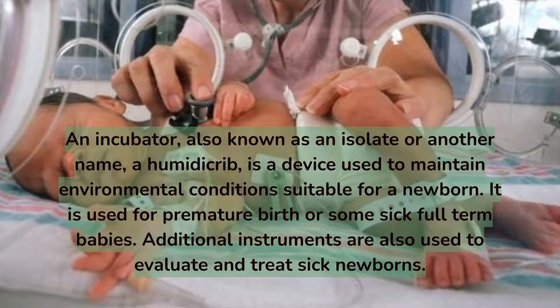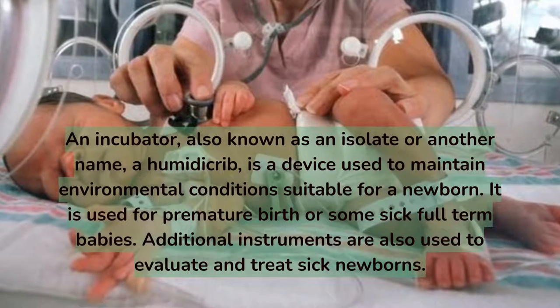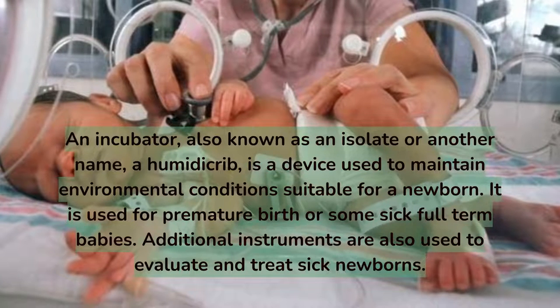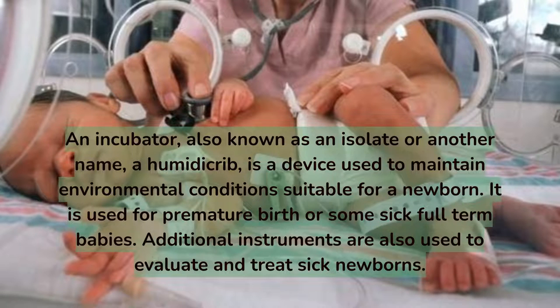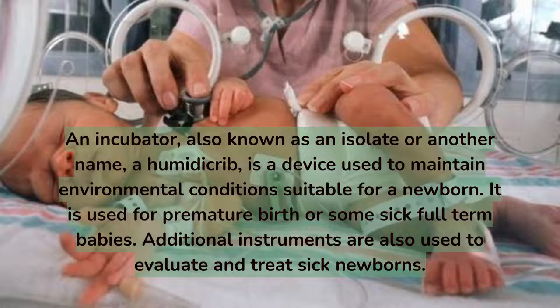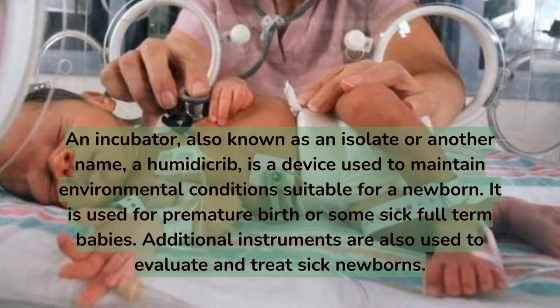An incubator, also known as an isolette or a humidicrib, is a device used to maintain environmental conditions suitable for a newborn. It is used for premature births or some sick full-term babies. Additional instruments are also used to evaluate and treat sick newborns.